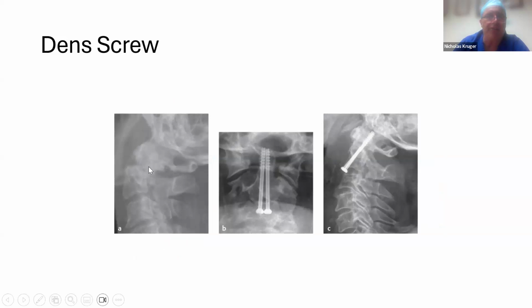So here's the peg displaced, and you can rearrange it. The patient's in a Mayfield clamp. Then you put the screws through, but it's quite tricky. You often do damage the C2-3 disc, and the screw may come out the back. You've got a guide wire, and when you drill over the guide wire, the wire might go into the head. It all becomes very awkward. So it's quite a fiddly technique.